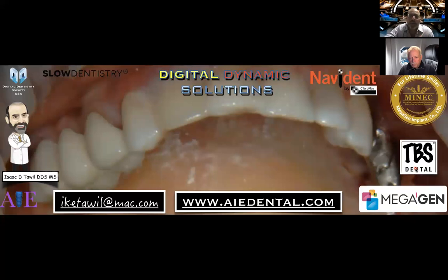So there's not going to be enough vital bone left for us to be able to place an implant properly. If you do place the implant, it's kind of like rolling the dice, because we have to hope that area is somehow going to get revascularized.